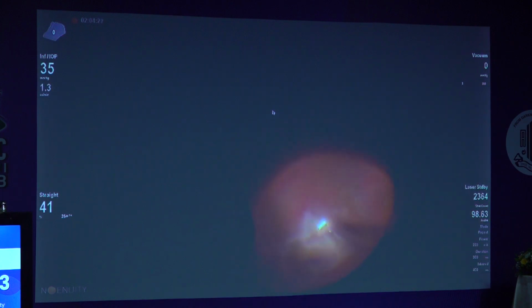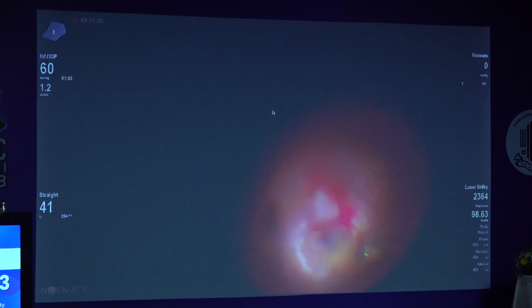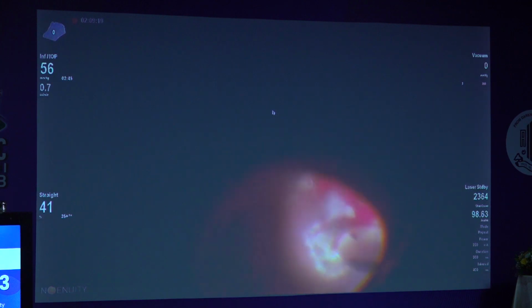Now we will be cutting the retina and the choroid both. If you want retina, you can take retina only, but if you want a retinochoroidal biopsy, you can take both, and you will be seeing some bleeding, but the bottle height can be raised. Eventually, retina and choroid will separate from each other, so you can take them out one piece after the other.